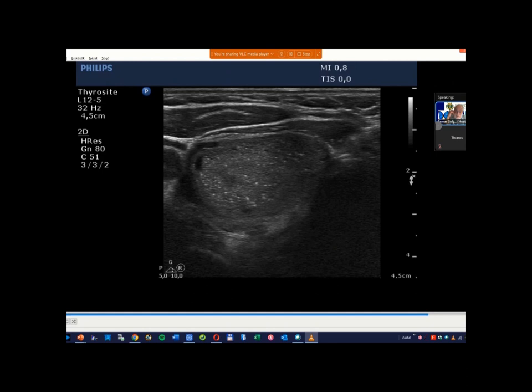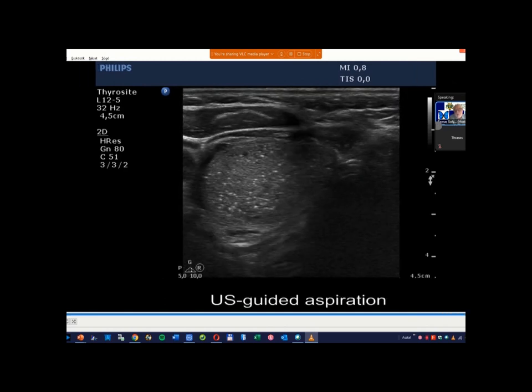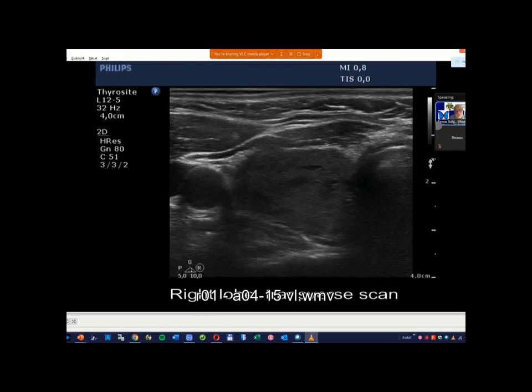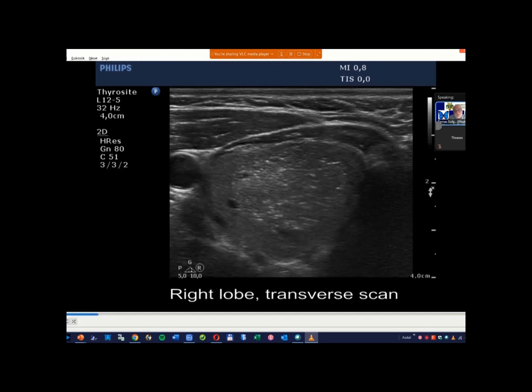Microcalcification, as will be discussed later in this webinar, is the presentation of a tip of the calcified papilla or psammoma body, and the only histopathological entity which contains psammoma body is the papillary cancer. Okay. Other comments, questions? If not, try to memorize this pattern, this quite regular distribution. It is not a frequent finding. So a nodule with such extensive fibrotic changes is an exception.